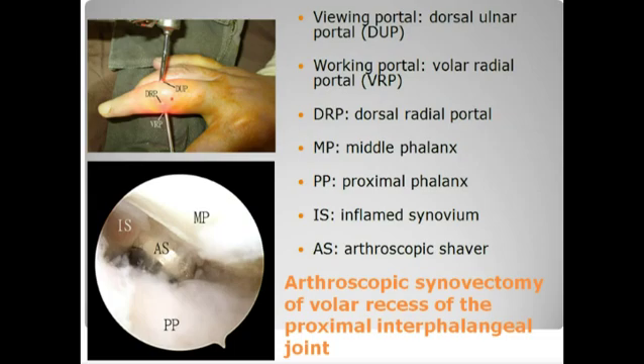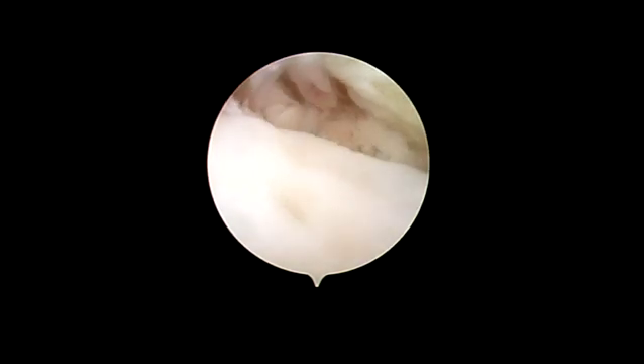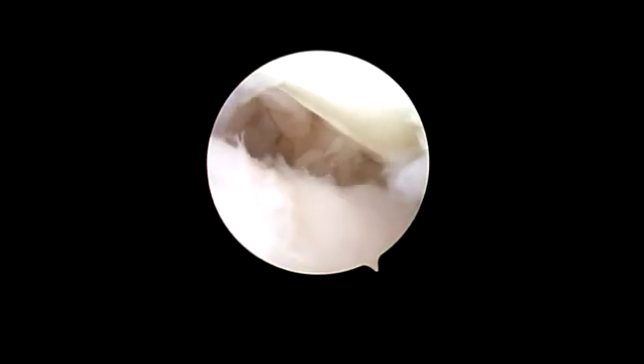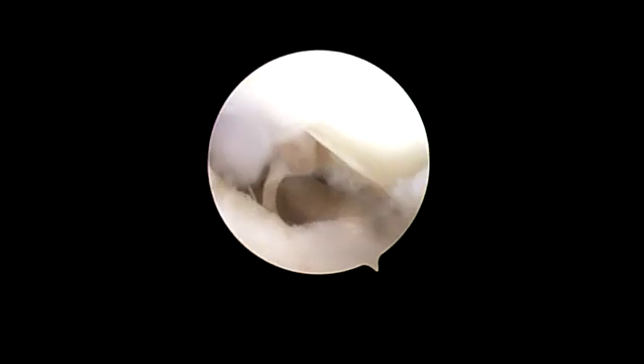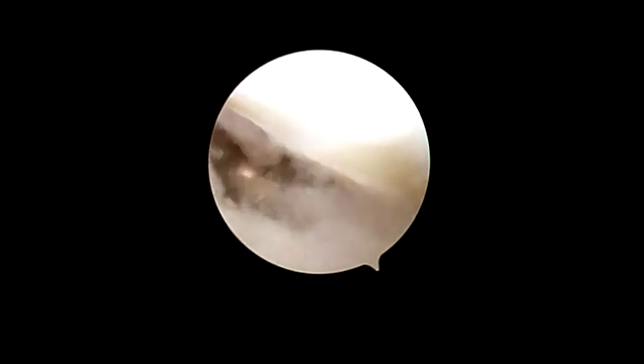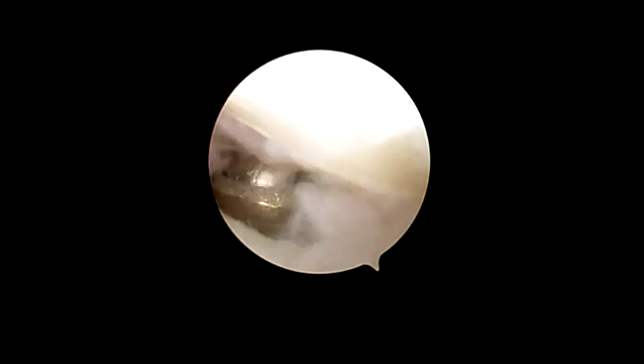Finally, the volar radial portal is created under arthroscopic guidance. Then, with the dorsal ulnar portal as the viewing portal, the volar recess of the joint is debrided with an arthroscopic shaver through the volar radial portal.